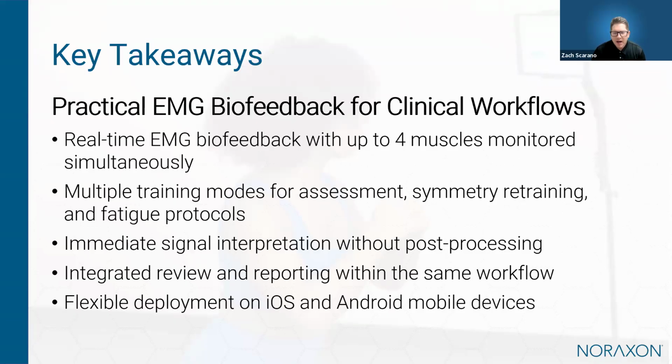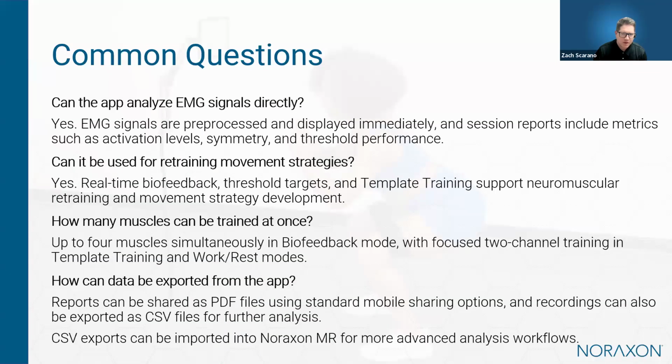And so, with that all in mind, I'd like to briefly address a few questions that were submitted by registrants before the webinar. A few good questions came in ahead of the webinar. One question was whether the application can analyze EMG signals directly or if additional processing was required.